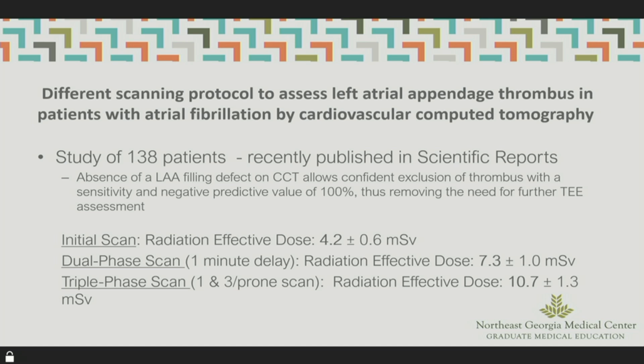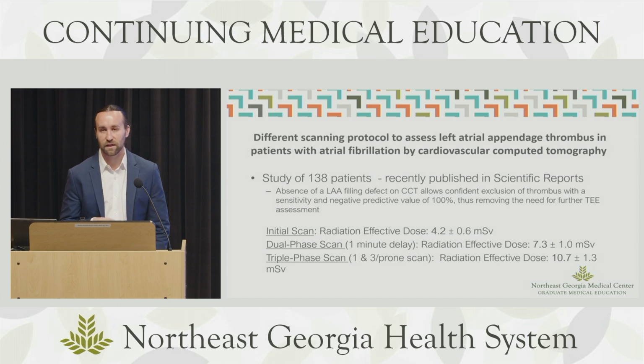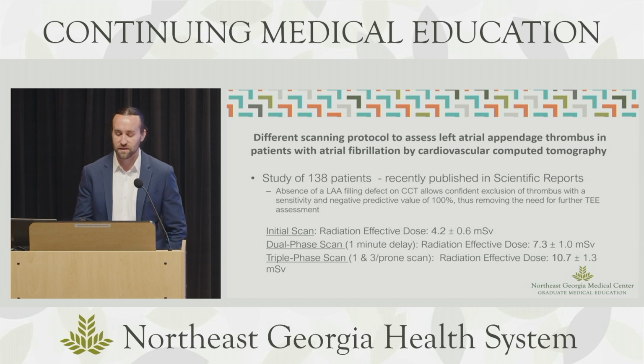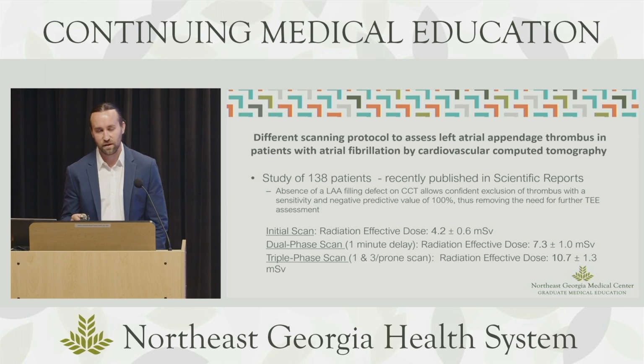So this study that was recently done, which we talked about in the last slide, included 138 patients and was recently published in Scientific Reports. They showed that the absence of a left atrial filling defect on CT allows for a very confident exclusion of thrombus, with a sensitivity and negative predictive value of 100%, thus removing the need for further TEE assessment. Now, I just want to preface here. If it comes to that first slide where there is no evidence of any kind of filling defect in the left atrial appendage, you can very confidently say this is definitely no evidence of thrombus. But if you have a filling defect, you can't necessarily say with 100% confidence that this is a thrombus without delayed imaging or considering a TEE to completely exclude that.